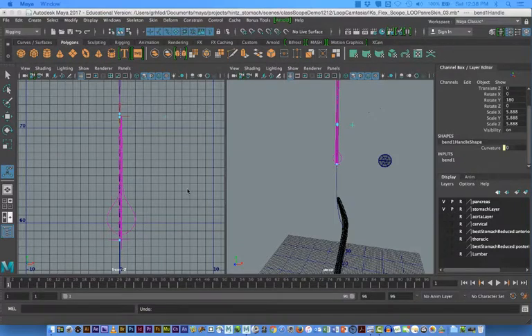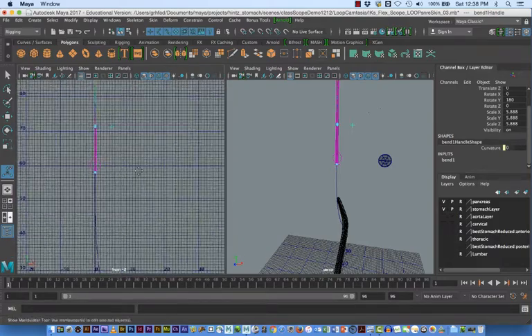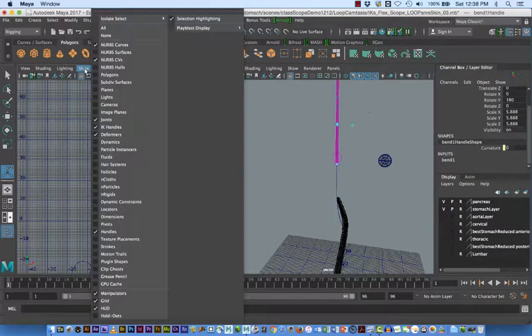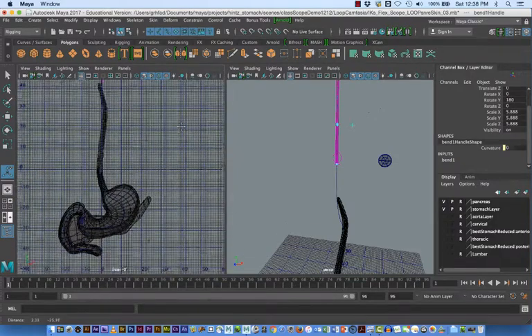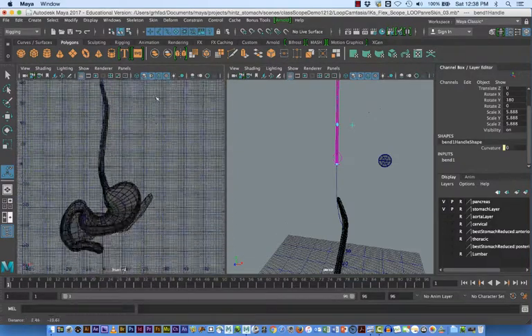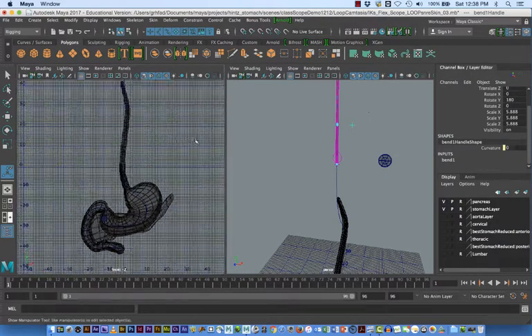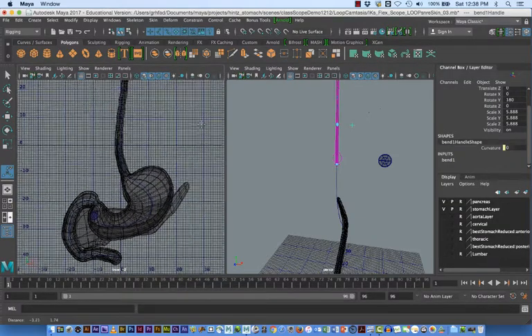And unfortunately, this is going to be a little boring, so I may pause the tape a couple times. What I want to do is basically get the scope, and more specifically the loop, at the point it should be to grab that battery. Although it's a little boring, I want to show you some suggestions on how you can do that.